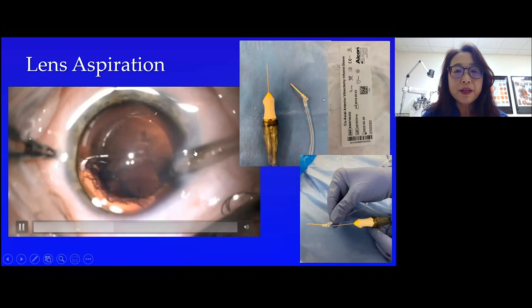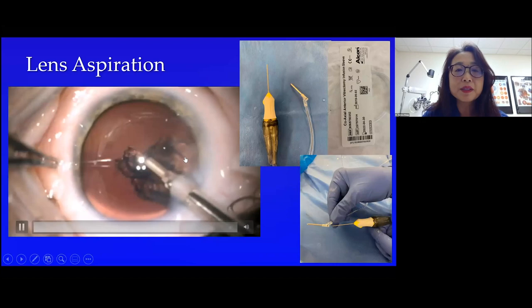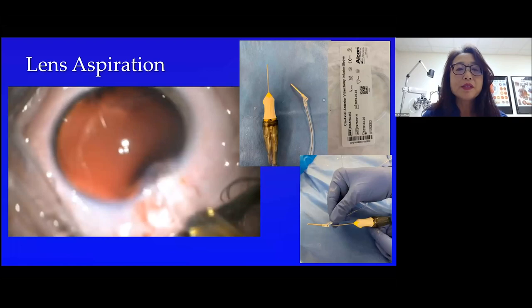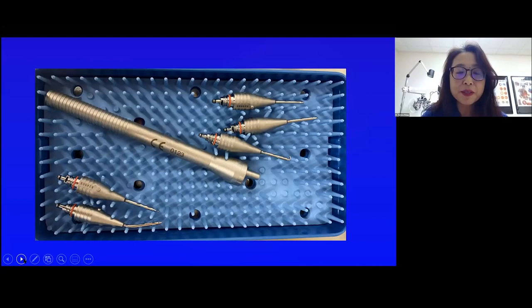Again, it's very important for pediatric cataract surgery. You really want to make a clean surgery, because even if you do a really good surgery, they can still regenerate the cortex. So this is just a quick showing of all that being done. I've been doing this technique for the past 15 years. I think it works really well. If you have trouble getting the subincisional cortex, those good old instruments are still very helpful.